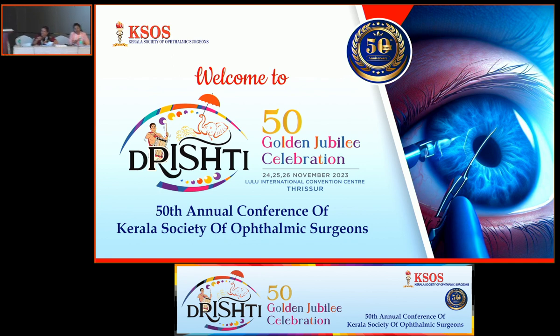Yeah, so if you have noted, I didn't do a hydrodissection in any of these cases. So that is the point I wanted to stress, because most of the time, if you just do a hydro, the whole lens nucleus, which is anyway soft, comes out, and your lens aspiration is over in a jiffy. But in these cases, you have to be careful. Just because the lens matter is soft does not mean that it cannot have a posterior capsular deficiency or a pathology. So ideally, you have to have a good preoperative assessment.